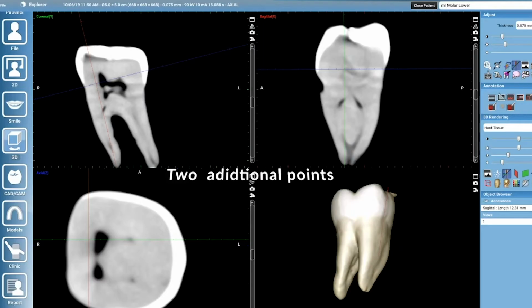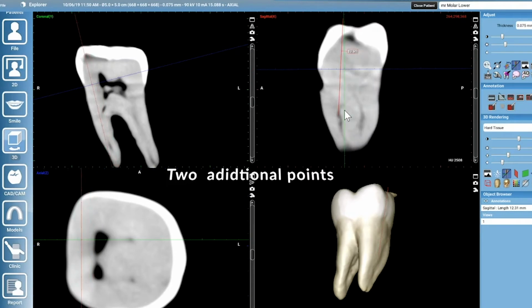Interesting finding when I was negotiating the mesiolingual root. Here, let's just scroll through this root. I found at about 12 millimeters, marked there the working length, my 08 hand file started to create a ledge. The ledge was just forming literally here, and I hadn't noticed this impediment, what appeared to be a pulp stone in the midroot area.